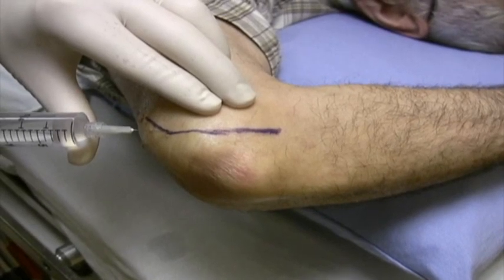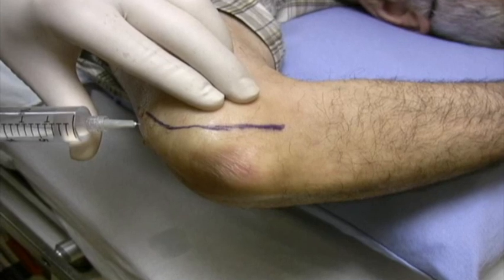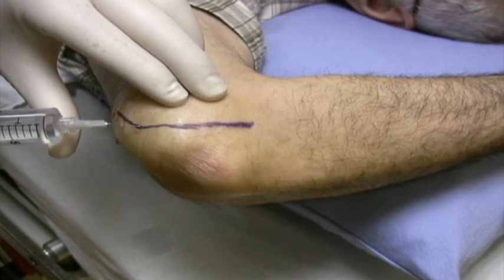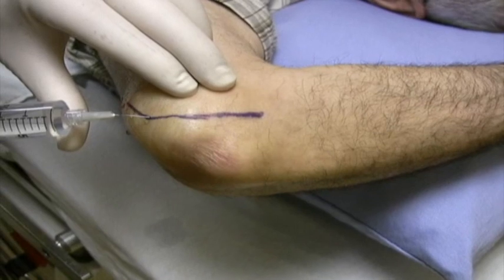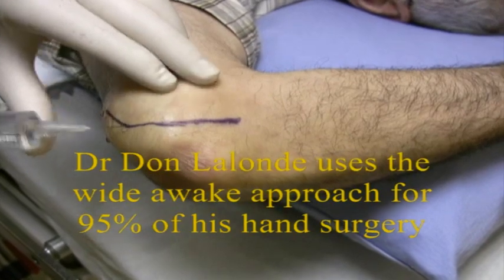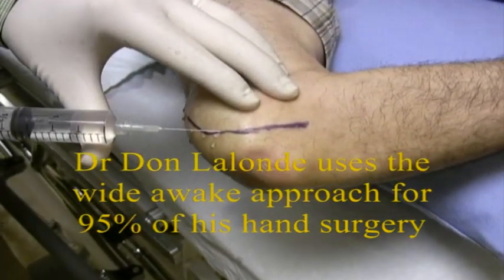And I'm not a golfer. This is as close to golf as I get, but every time I put in a local anesthetic, I do score myself, because I think that we can always get better. My goal is to get a hole-in-one every time I do it. So far, we're winning on this gentleman's carpal tunnel and on his ulnar nerve. But he's going to tell me. We're not going to do any lying here.